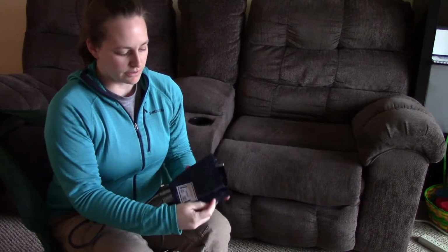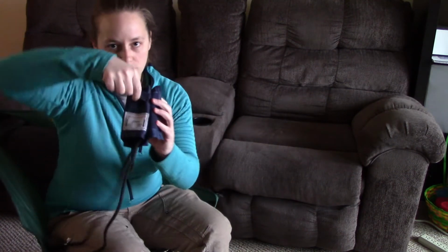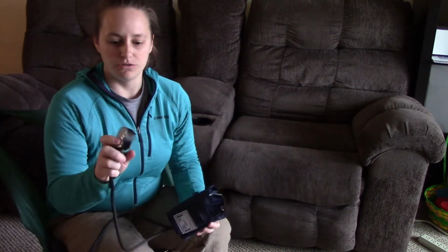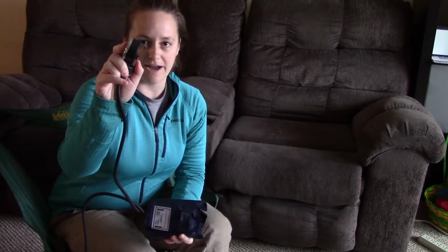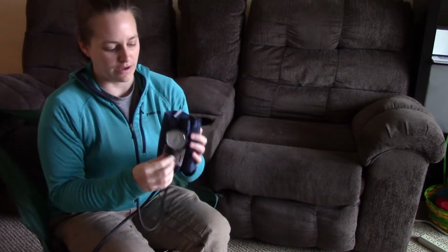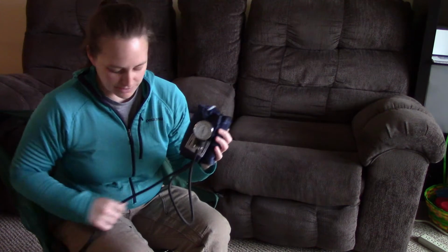The next thing you can do is most blood pressure cuffs have a little loop here, and on the back of your gauge you do have a little clasp. So you can use that clasp to hook onto the loop, and that way your gauge is attached and you don't have too many pieces to hold.